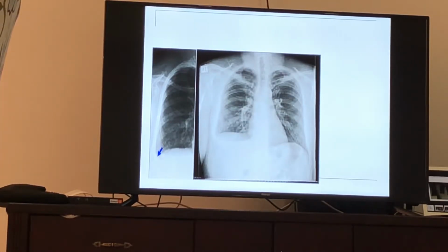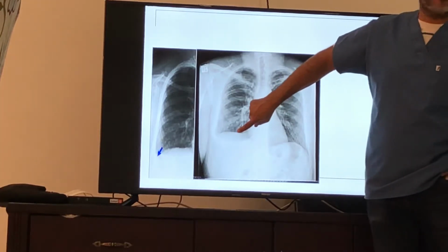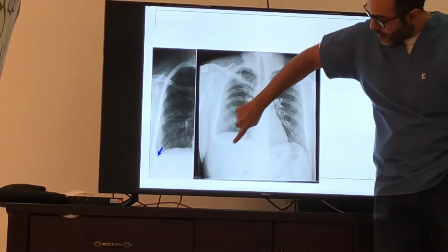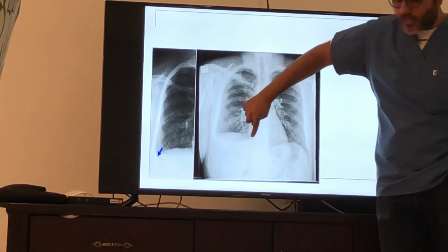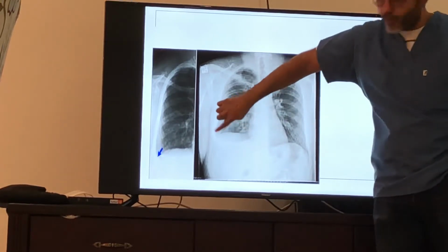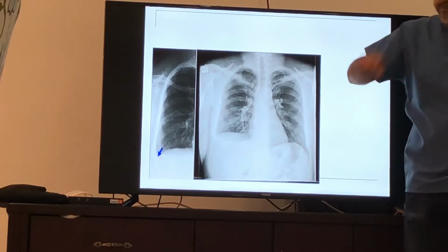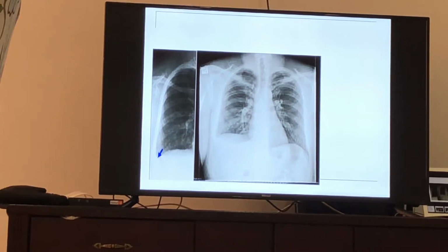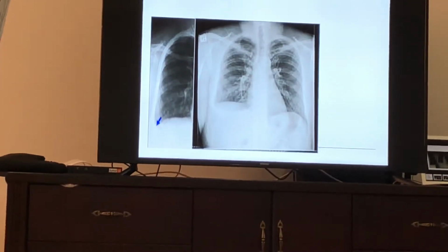Doesn't this have a term? It should be rising to the axilla. It is, but it's not enough to cover all the diaphragm. Look at how the meniscus forms. They are rising in capillarity, and the pressure changes inside the pleura make it look like a meniscus. At a certain stage it looks like that, and transudate more than exudate gives this picture, because its density is more watery. But we see subpulmonic effusion a lot.